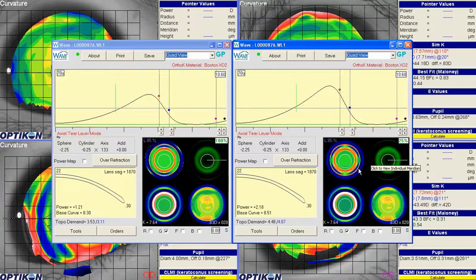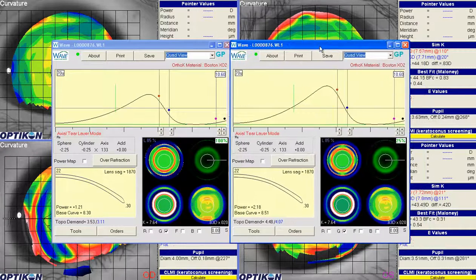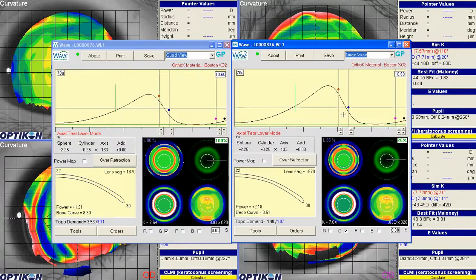All right. Again, as far as changing the diameter of this lens, if we look at the topography, it is a little bit loose in the periphery, but the lens is centering well. And I would say if it's centering well, even though the topography does not look ideal, I would not change the fit to the lens unless we needed to. So here's the lens with increased topo demand. Not changing the fit or the diameter of the lens should help with the patient's vision.